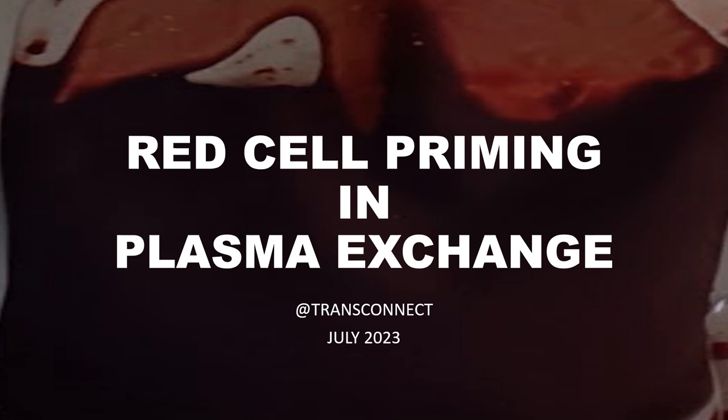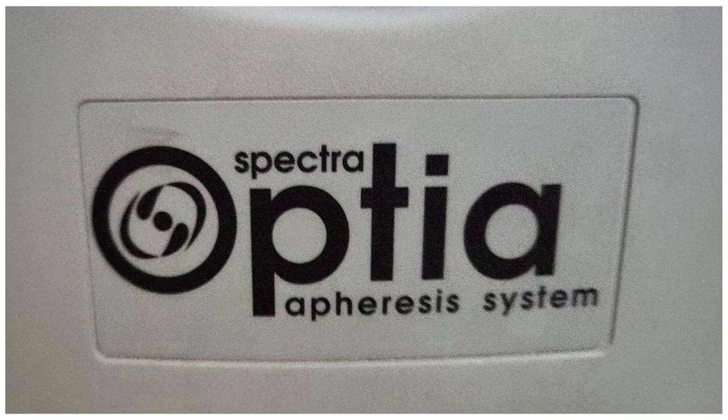Red cell priming is usually done in patients with very low hemoglobin or in pediatric patients with very low blood volume. Today our demo will be using the Spectra Optia apheresis system.